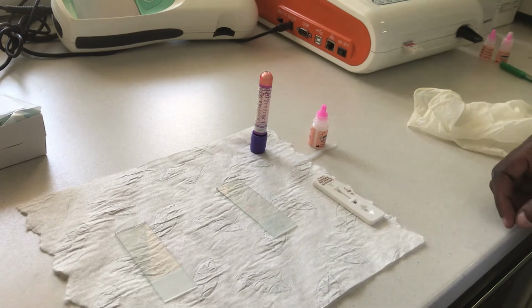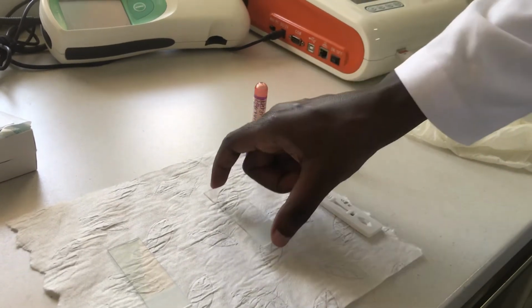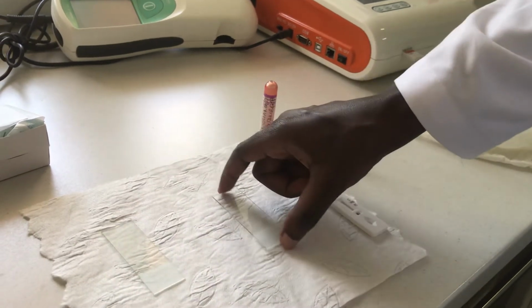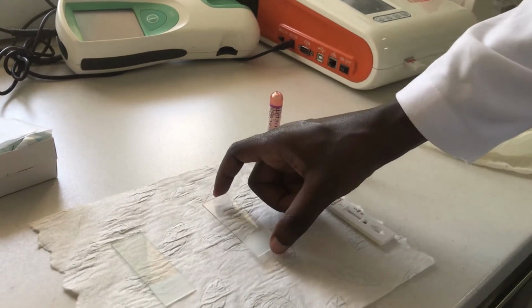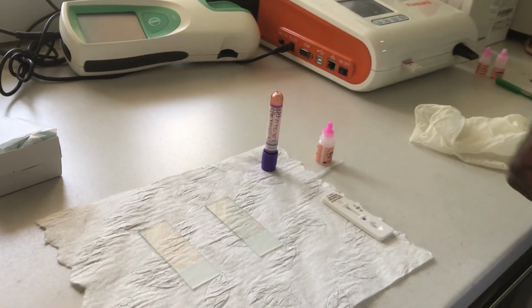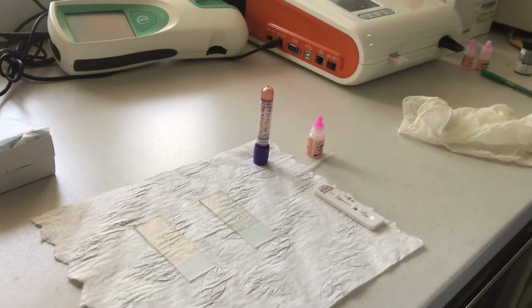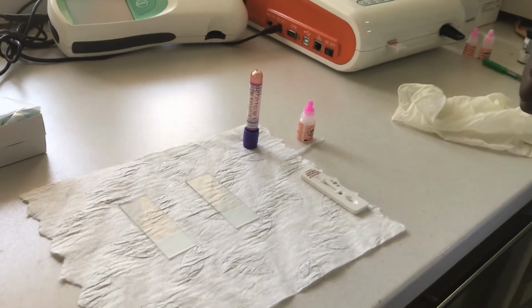So one of the methods we use to diagnose malaria is through using a rapid diagnostic test kit for malaria specifically. Secondly, we usually use a slide or a smear, a malaria smear. You can either have a thick smear or a thin smear if you want to diagnose malaria. So I want to take you through briefly, practically here, how you can diagnose malaria.